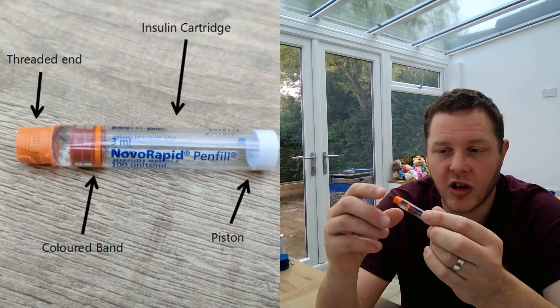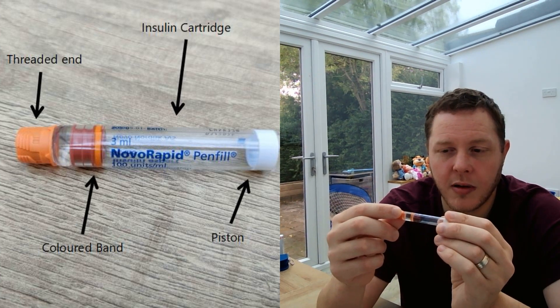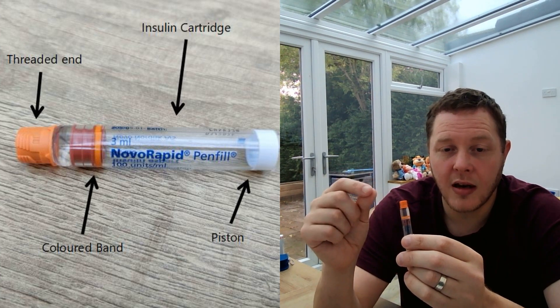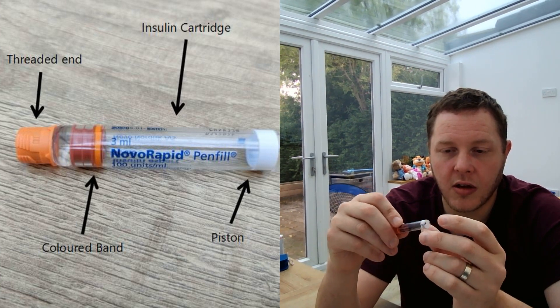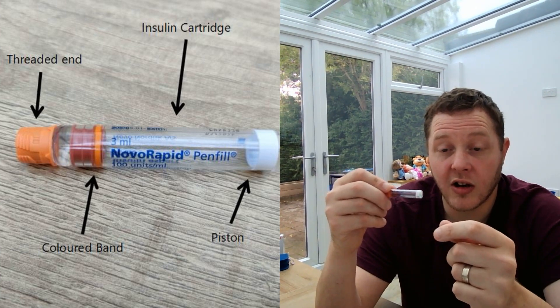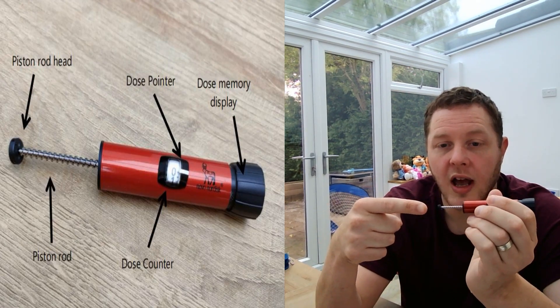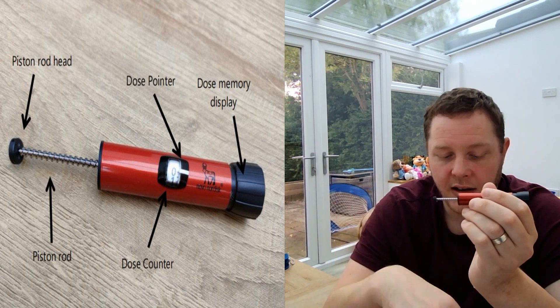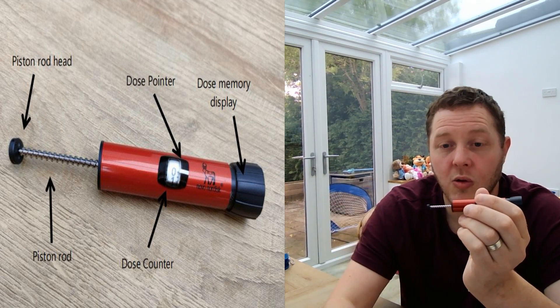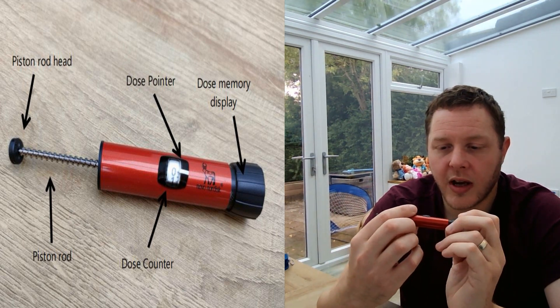Looking at the cartridge itself, it's got a colour band — an orange band, which indicates this is Novorapid. It's got the threaded end, and that's where your needle will connect onto the pen. It's also got the piston at the bottom, which will push the cartridge along so that it can inject into you. Looking at the pen, you've got the piston rod head and the piston rod, which will connect and push along to connect to the cartridge and allow you to inject.